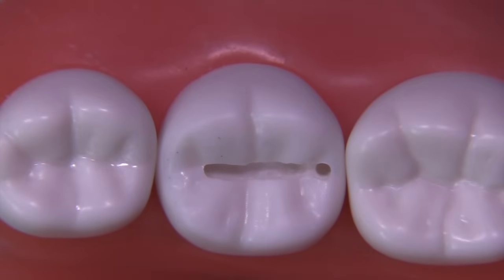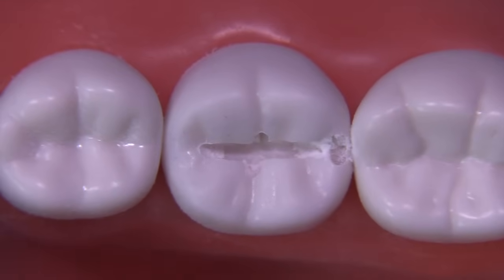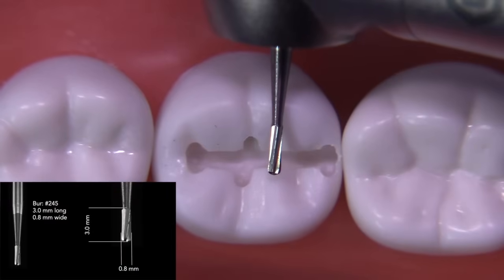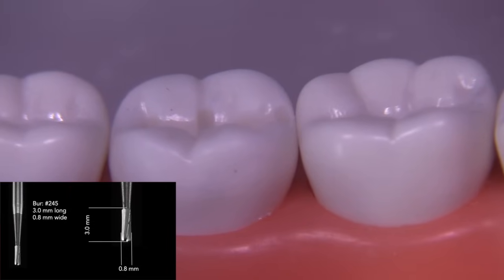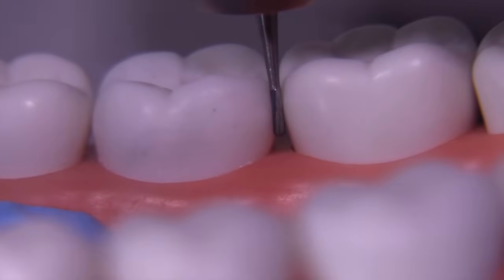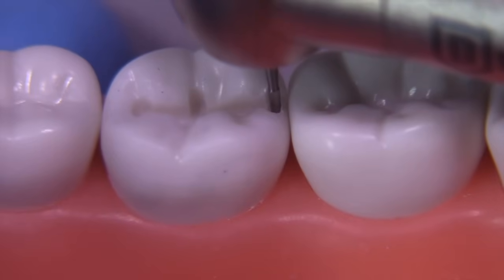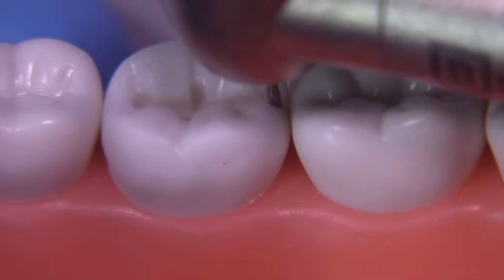This is the initial slit down the occlusal surface. We're going to extend about a millimeter of the buccal fissure and the lingual fissure. Then we're going to widen the proximal just a little bit so that we can use our 245 burr to drop the proximal box. You can hold the burr up against the side of the tooth and decide how far down the burr is going to go apically or gingivally, and get an idea of how far you need to push before you break gingival contact — it's just a way to save time.